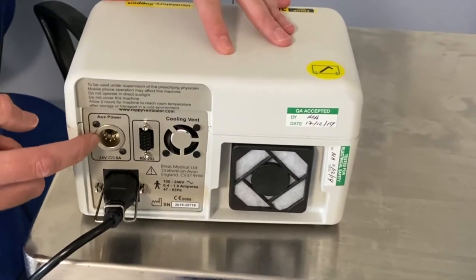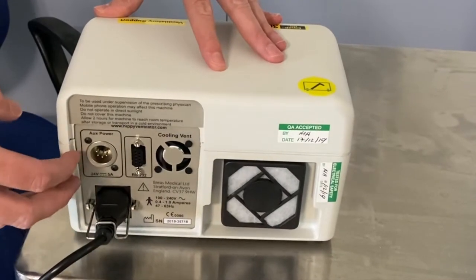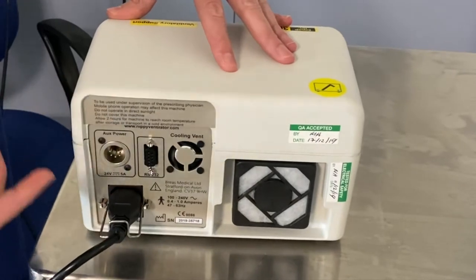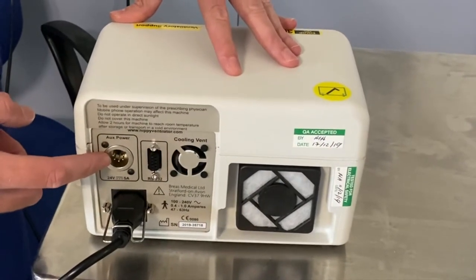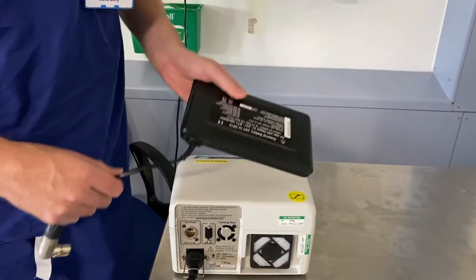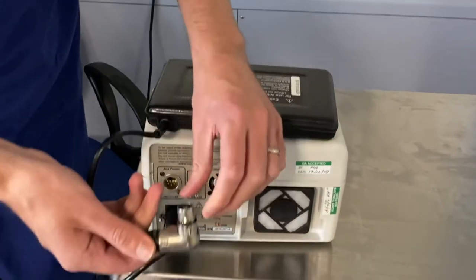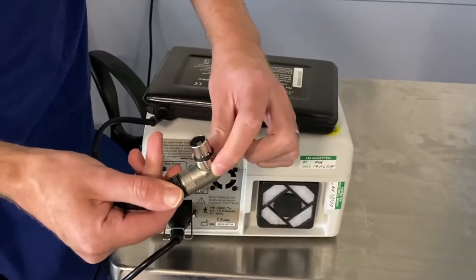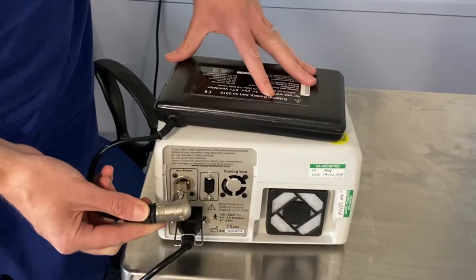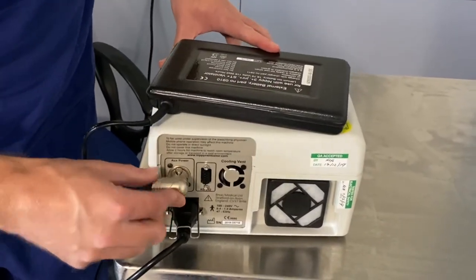The third feature you'll notice here is an additional accessory which we might use with you. Not all of our patients will have this in place, but for those that are more dependent on the ventilator we will attach an external battery. It sits on top of the machine like so. You can see the connection point — there is a little rocker button which we can push down. Make sure that rocker button is sitting at the top and simply push and lock it into place.